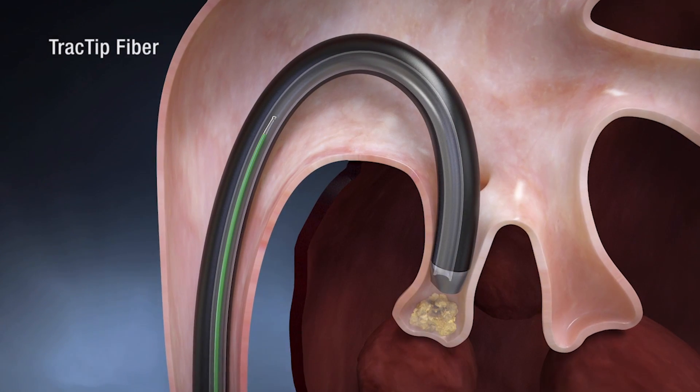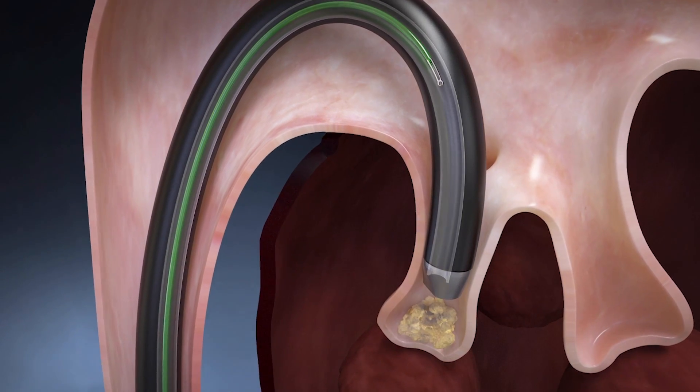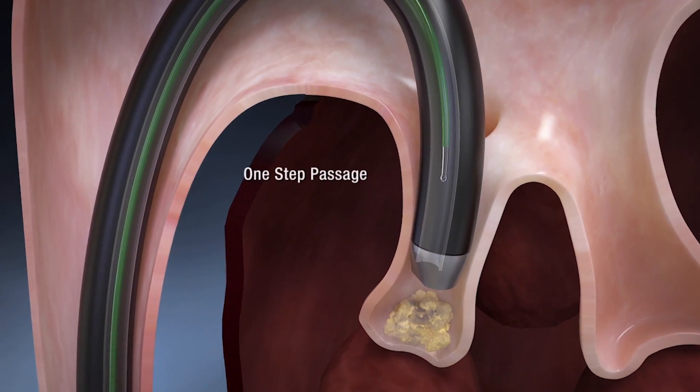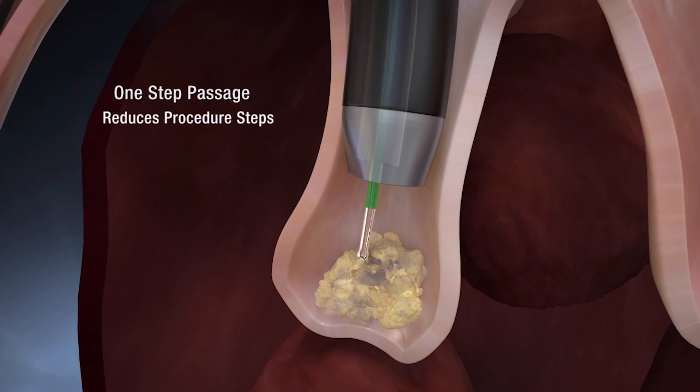The track tip can effectively pass through a fully deflected scope before laser energy is applied in one easy step. With one-step passage, the track tip can be used to reduce procedure steps in flexible ureteroscopies.